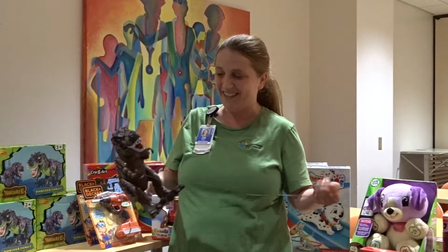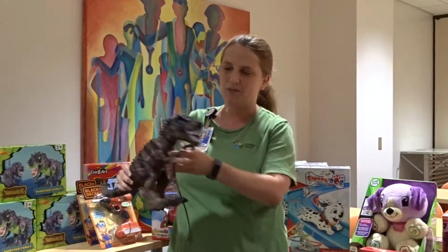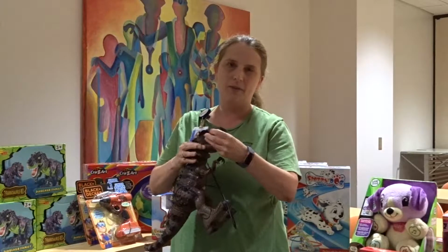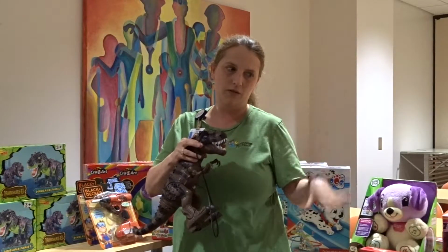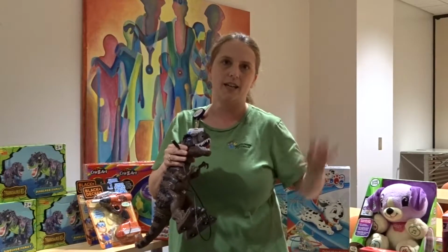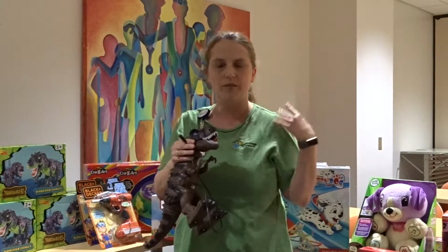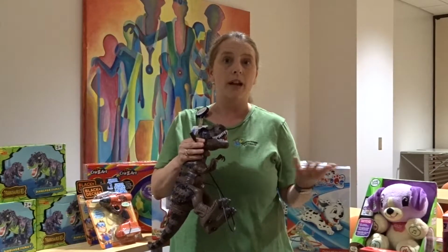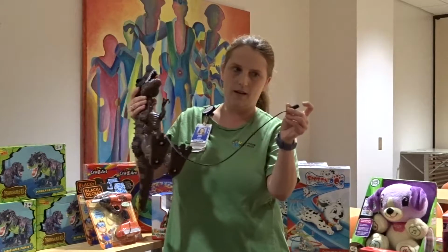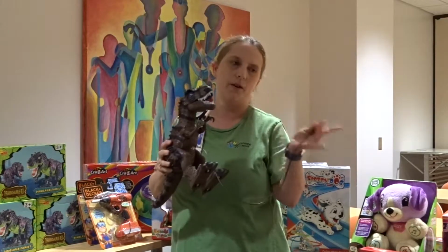So kids need to be able to play, and if they can't use their hands to play with a toy the way other children can, it's important that they be able to use the skills that they do have to play with the toy. And so sometimes that means activating a button either with their hand or with their head or with their foot, whichever part of their body they're able to use. And they can do that through these toys. The switches are plugged in, and then the toy will operate every time they move that part of their body.